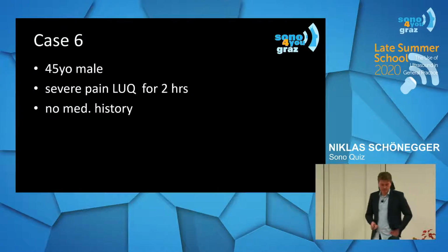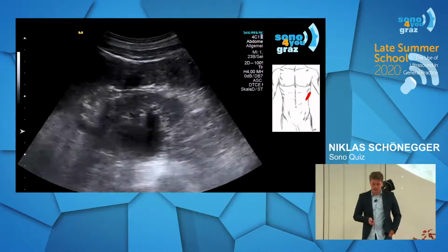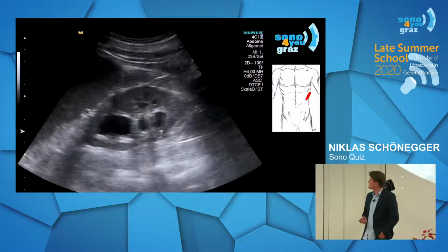The next patient is a 45-year-old male with very severe pain in the left upper quadrant here for 2 hours. He also had no remarkable medical history. And this is the image you acquired.